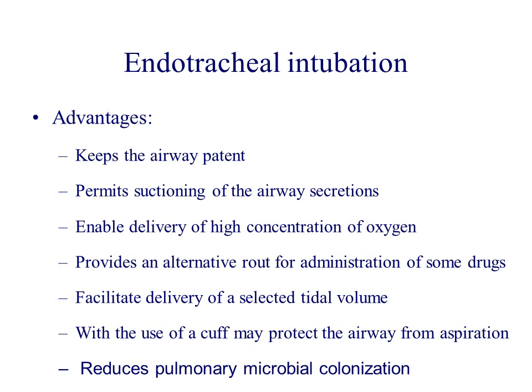In the past, they were using the mechanical ventilator or the endotracheal tube to give a drug. Nowadays, we don't use this route for administration of drugs. It facilitates delivery of a selected tidal volume with the use of a cuff that is inflated after insertion. We can prevent aspiration, so that we can decrease pulmonary colonization or any infection.